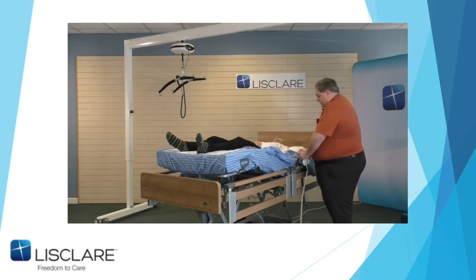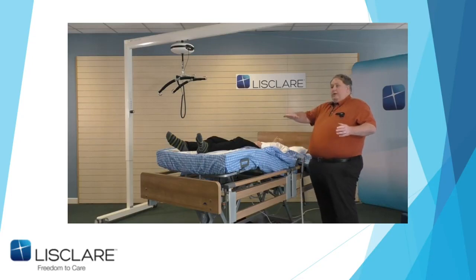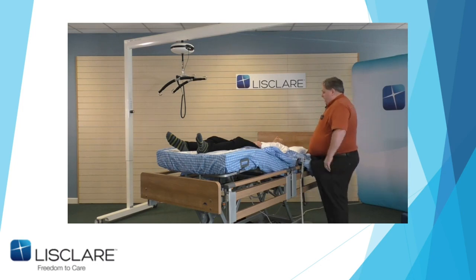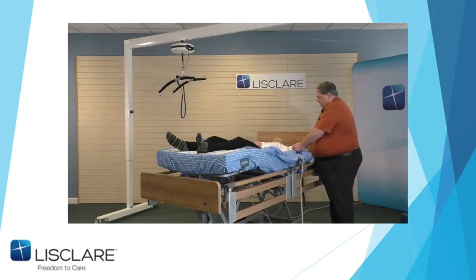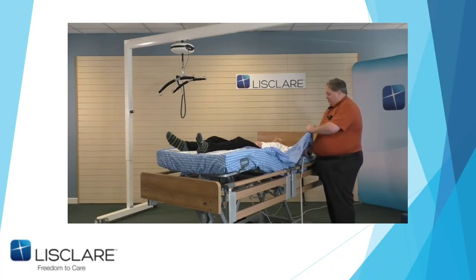And the reason why is this sort of situation is usually in the home, and you're not allowed to have a standard reverse Trendelenburg. Okay? Now, my access point I want to be is here, so that I can grab the sheet at John's shoulders. And I'm going to show you a wee cheat, and this is a wee shout out to Irv, who I didn't put in the presentation. Irvin Sahota is from London. He was a physio. He took after Hogan. He was one of the martial art experts. He was basically Hogan's long lost son, as far as I was concerned.